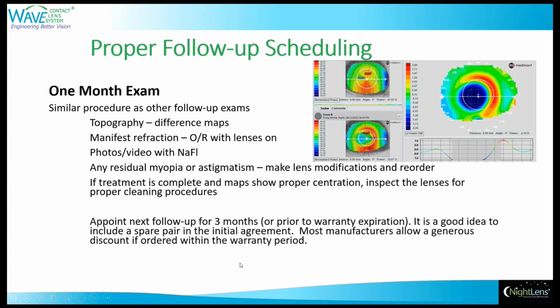But appoint the next follow-up for 3 months or prior to the warranty expiration. This is really important for you to schedule this visit after the 1 month exam to be prior to the warranty expiration.